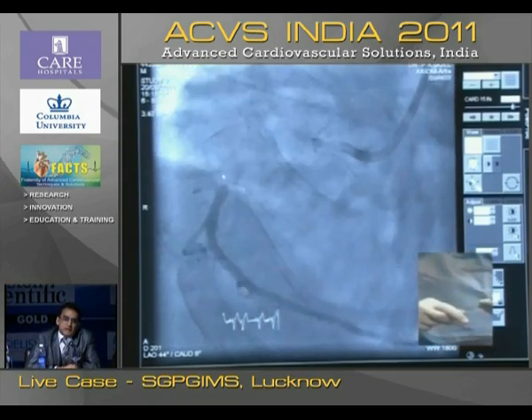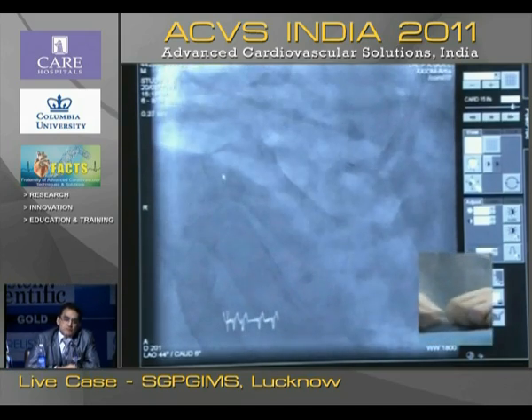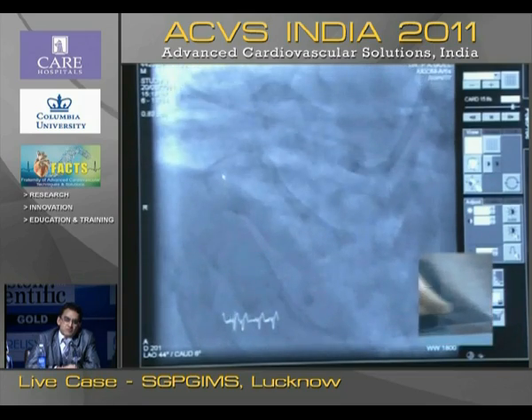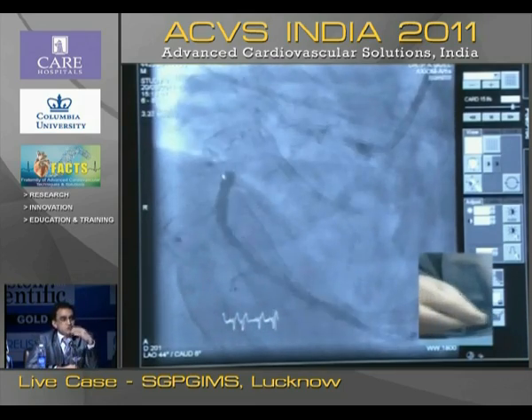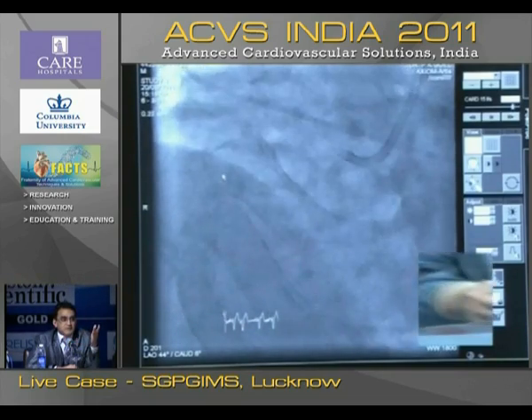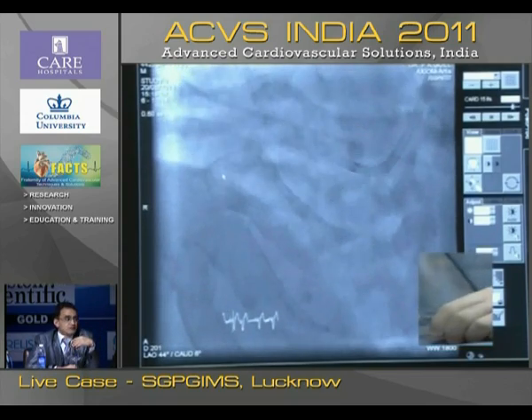No, Dr. Goel, it really doesn't look like there is any antegrade flow in that. It's not one of those cases where you have some very fine track and you can try. Yeah, there is no antegrade flow. I really wonder whether there is any point in trying with the whisper. Are there any comments from the house about this case, the choice of wire? You need a tough wire. I know first that the guiding catheter is important.